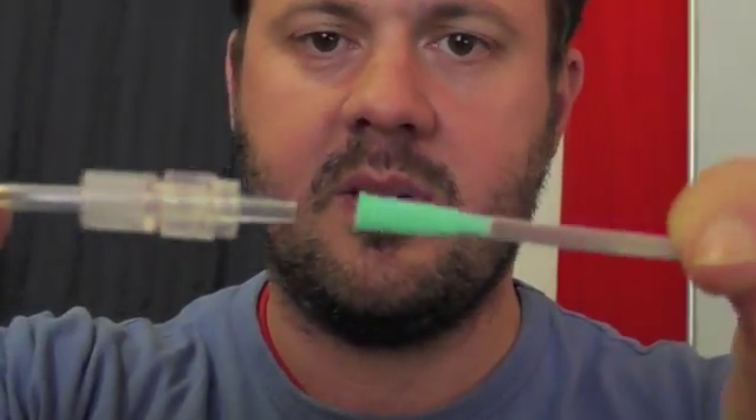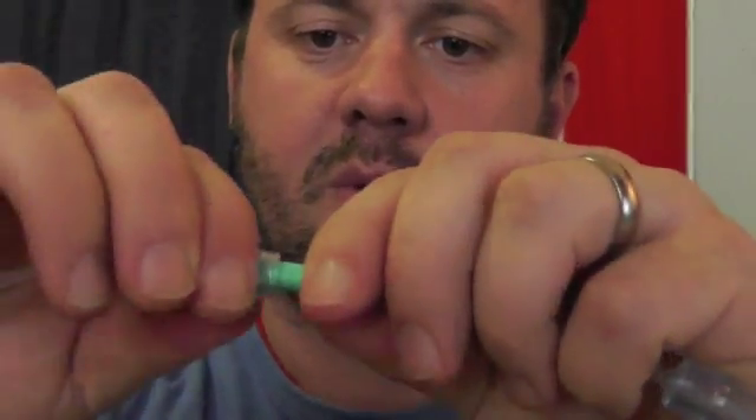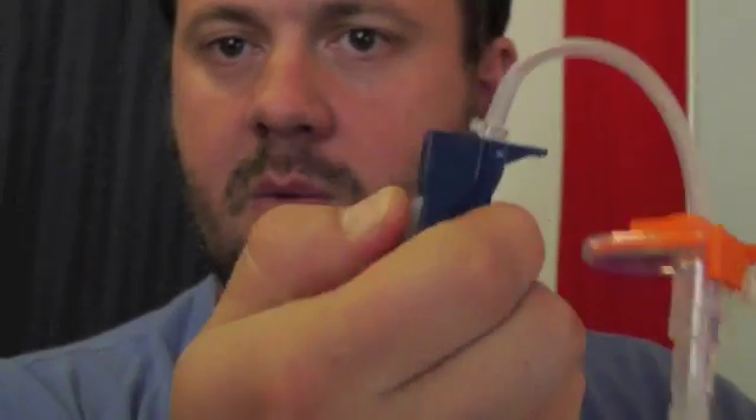Then all you do is you grab your IV fluid giving set and pop it in the end there. Some of them, this screw thing will screw on, some of it won't, but it doesn't really matter. It's a low-pressure system. It doesn't matter if it disconnects, you just jam it in there. And then that's the connection. So you've got a giving set hooked up to your bag of fluid, going into a mixing cannula, going into your oxygen tubing, and that will just gravity feed. You can use the adjuster on the giving set to decide how fast or slow you want it to go.